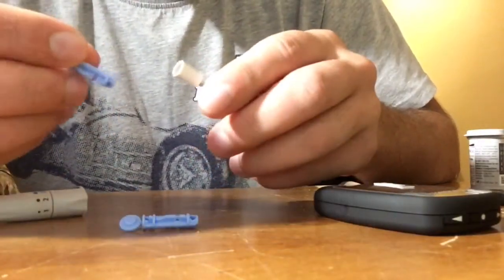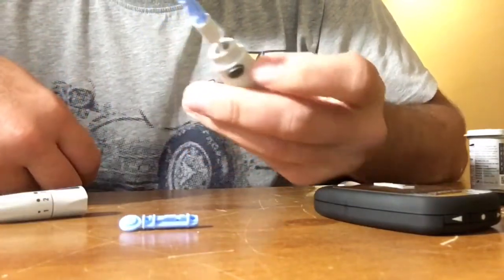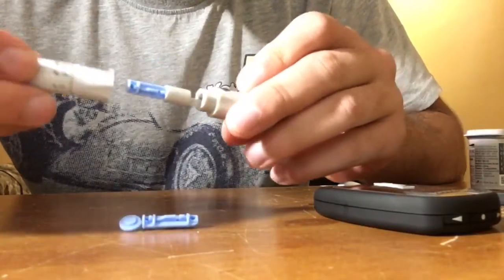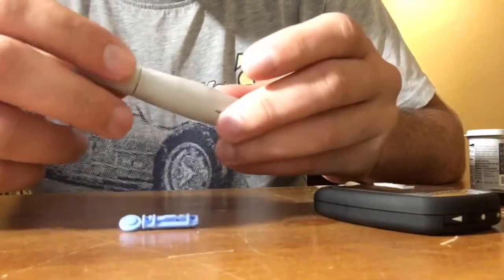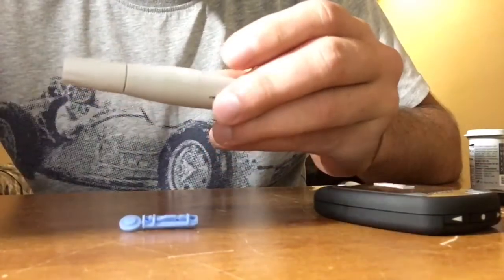I'm going to explain now what we use first. We're going to put this needle into the lancing device as gently as possible, and now we're going to cover it with its cap. Once we cover it, we just push it out to make it ready.